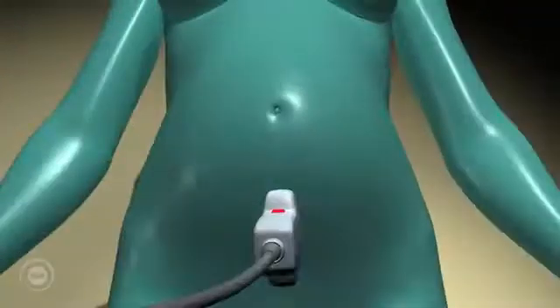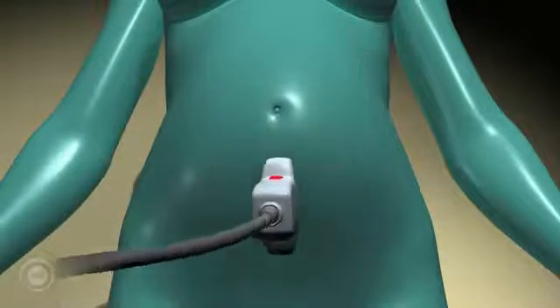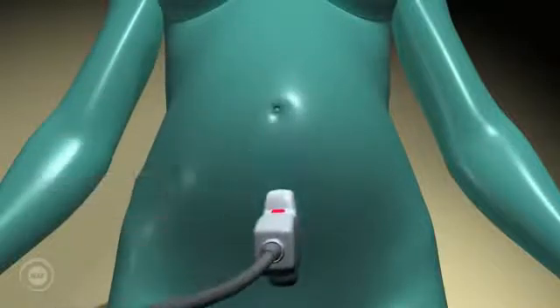a longitudinal plane. This means the long axis of the probe is lined up with the long axis of the mother. We then scan systematically up and down her abdomen, taking slices lengthways.